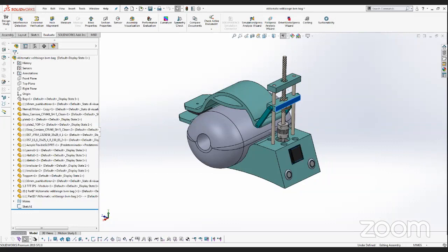Yeah, on the GrabCAD page, I uploaded also a simpler design that uses laser cut or CNC cut acrylic. So it's simpler and faster to make. There are still some parts missing, like connectors, but the idea is that, yes, it's simpler to make than the 3D printed version.